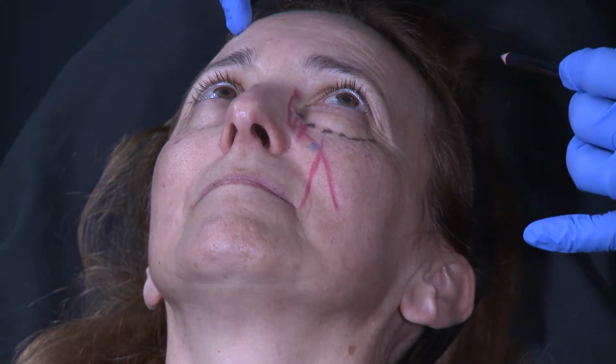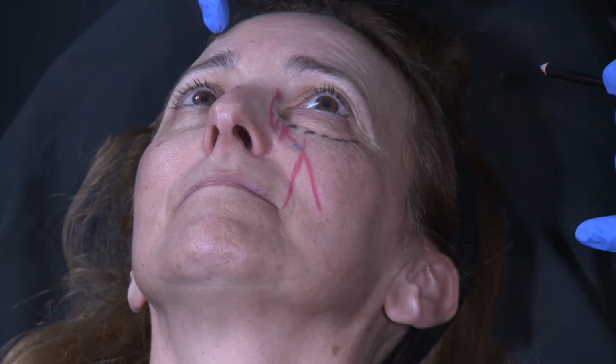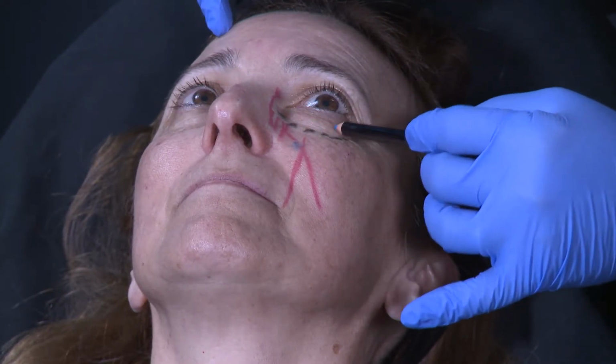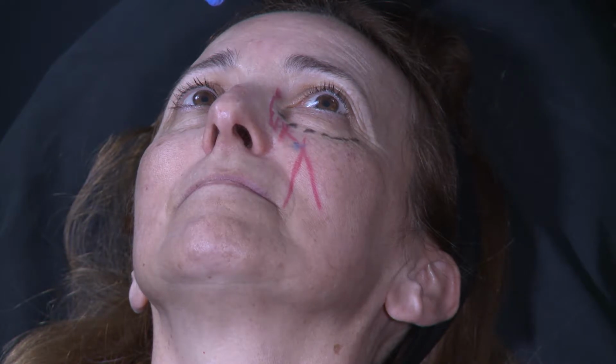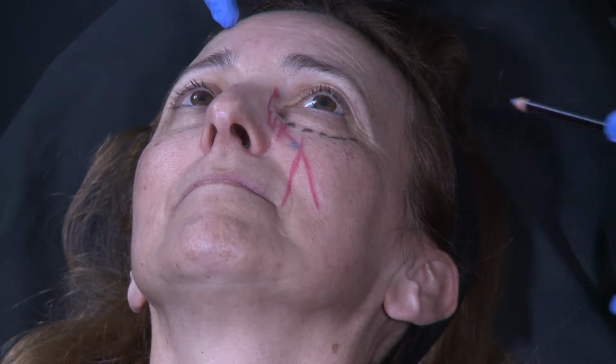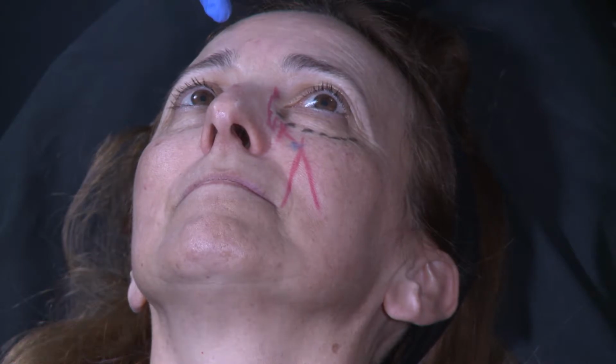So for me, I will use a cannula because I don't want my patient to have bruising after swelling. Because you know that here, the swelling and the bruising, I don't know if you had, but it will last a long, long time around the eyes. So I want to avoid any bruising in this area. So I will use a cannula for this.